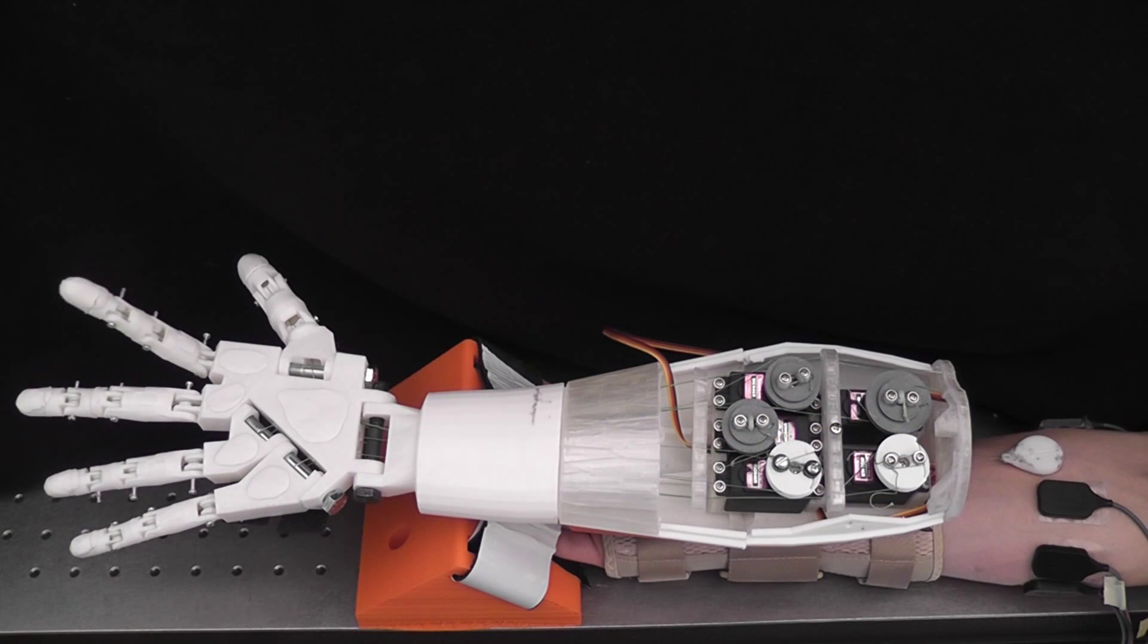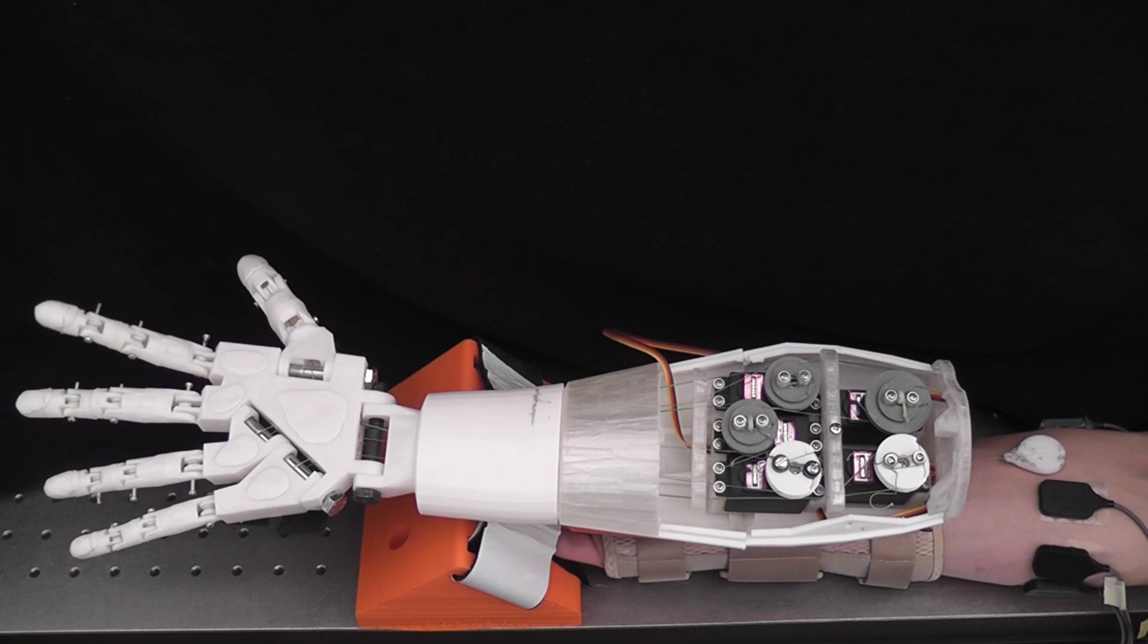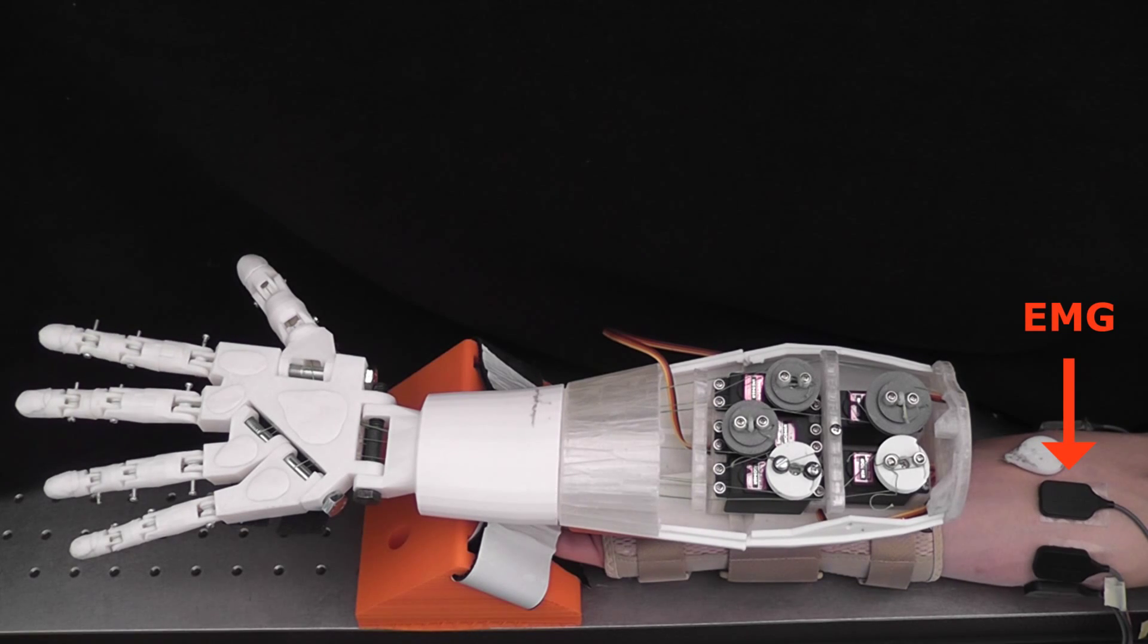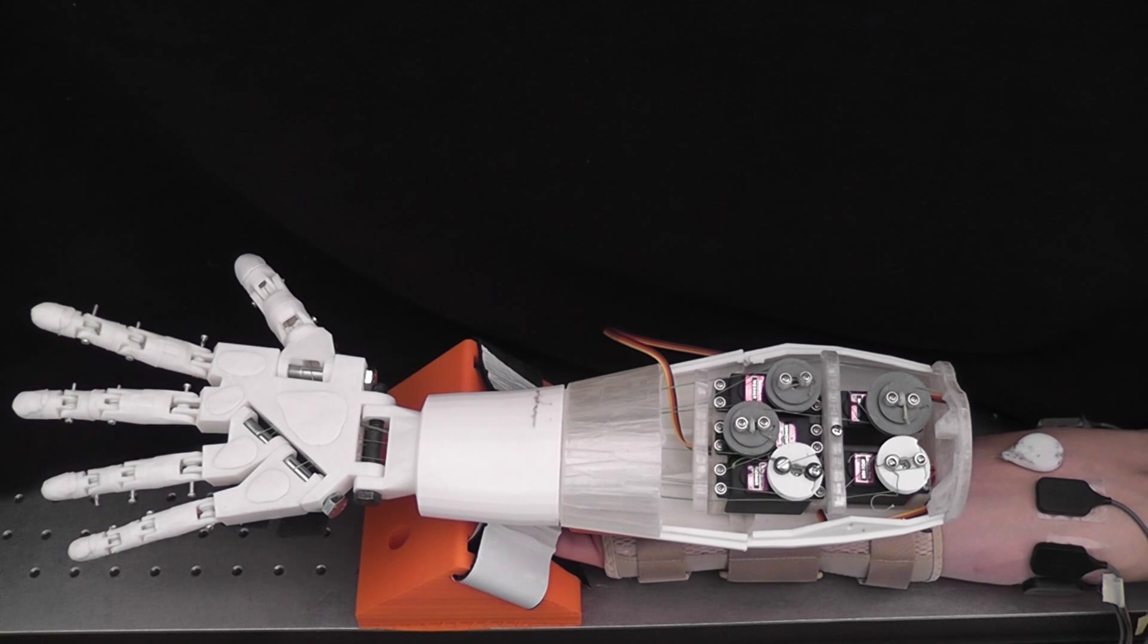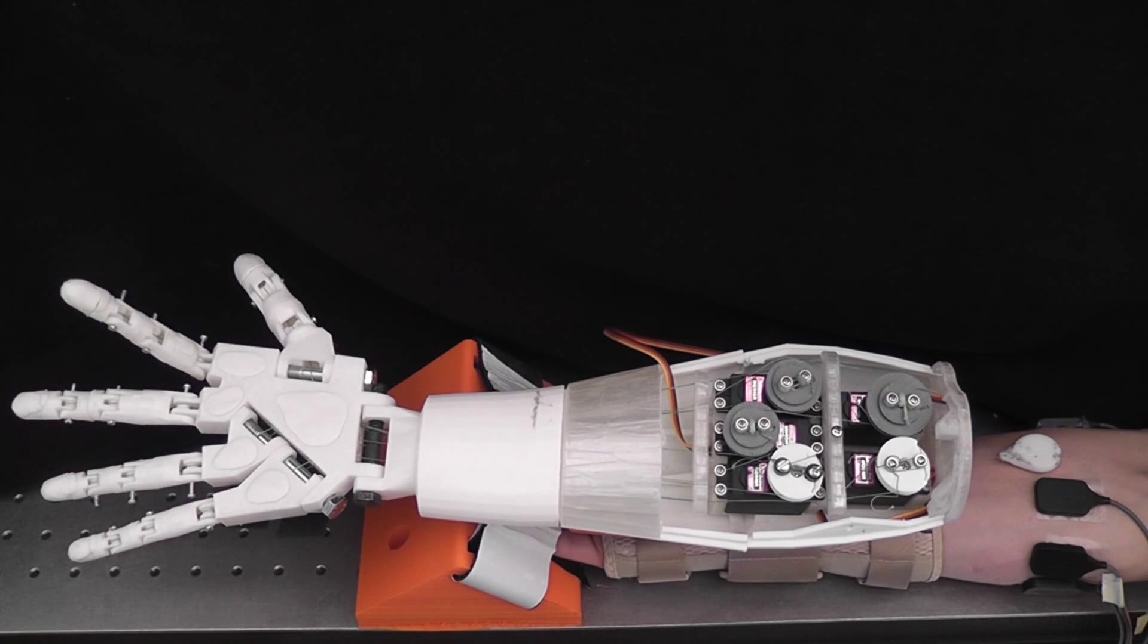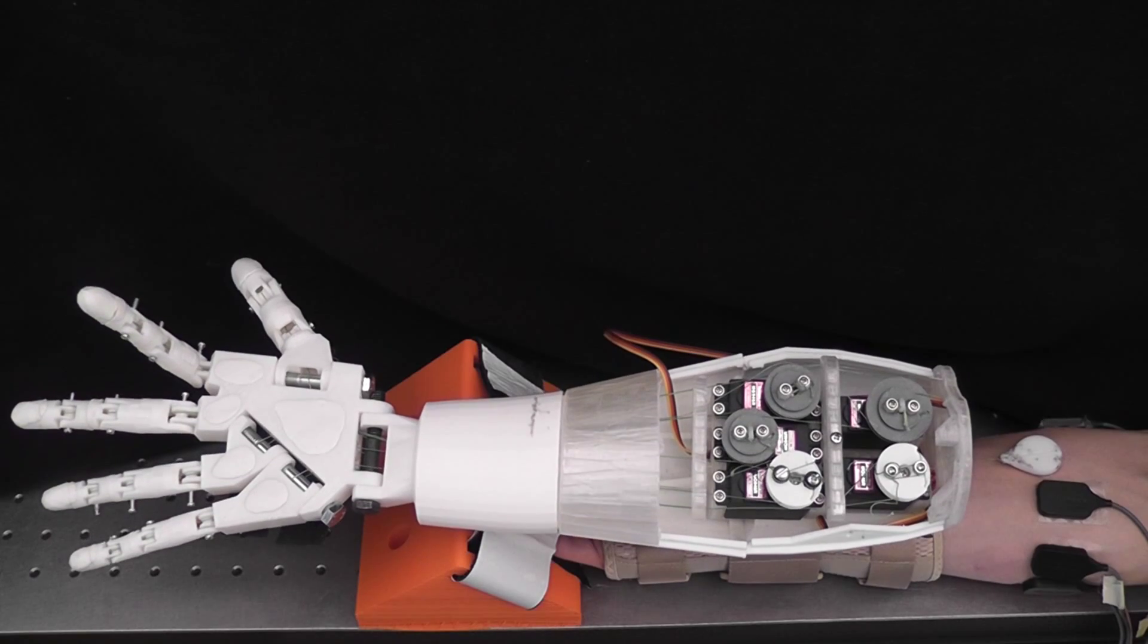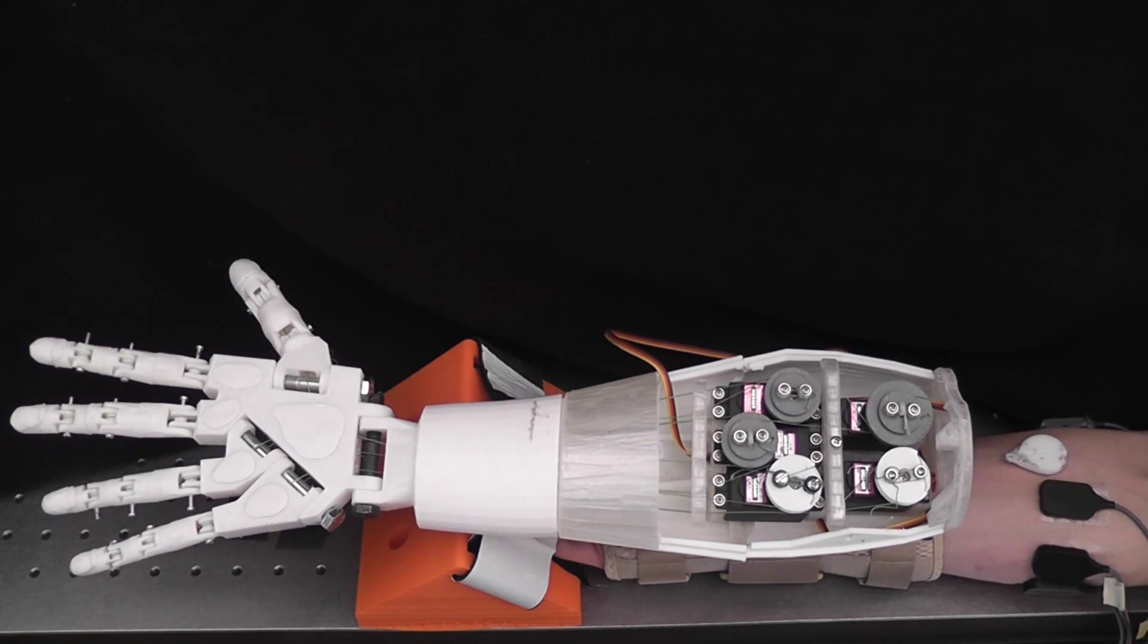Here we see a subject using the skin stretch feedback device. EMG is used to control the position of the finger and the white contact pad provides skin stretch accordingly. The subject's fingers are fixed so that he can only rely on the feeling of skin stretch to determine the angle of the finger.